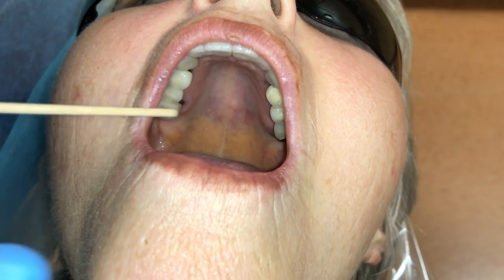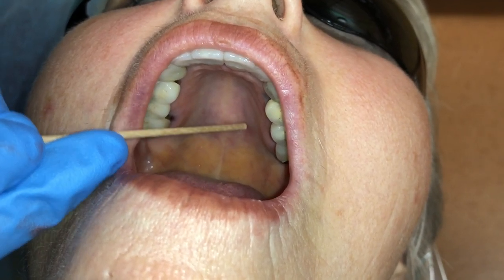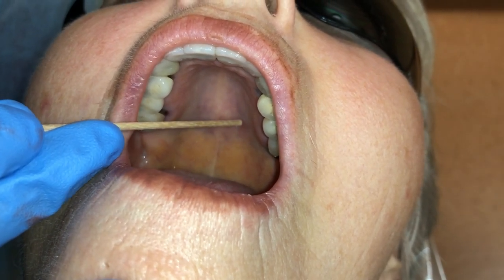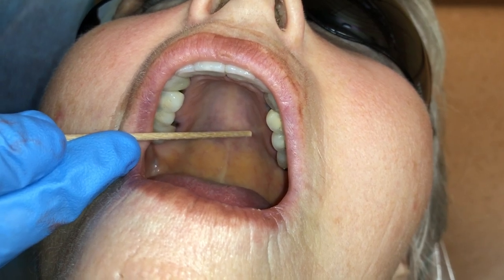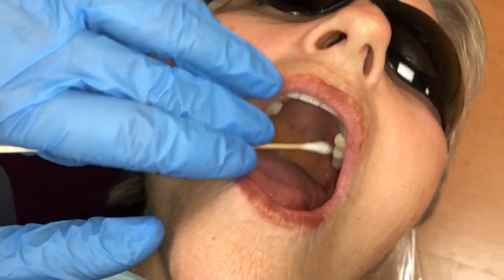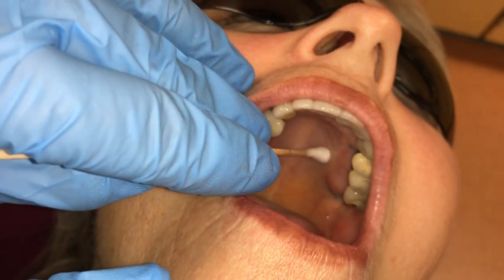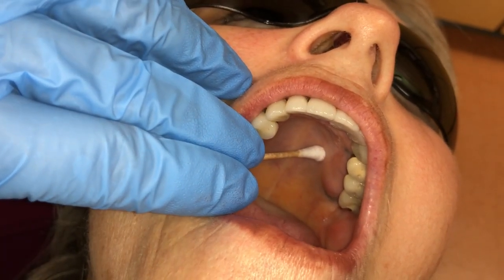You will notice in the video the clinician is pointing out the anterior-most portion of this depression. This is where you would insert the needle to deposit the bulk of the solution. As with all palatal injections, it is important that the patient's chin is up and the clinician can view the penetration location. When utilizing pressure anesthesia, the clinician can roll or slide the q-tip laterally or anteriorly.